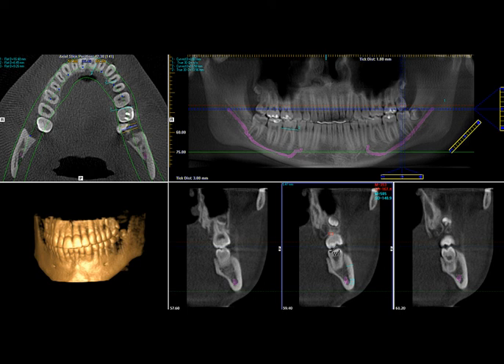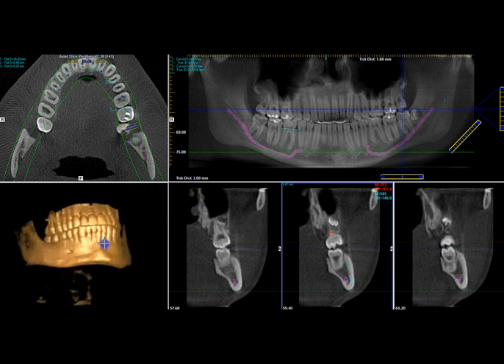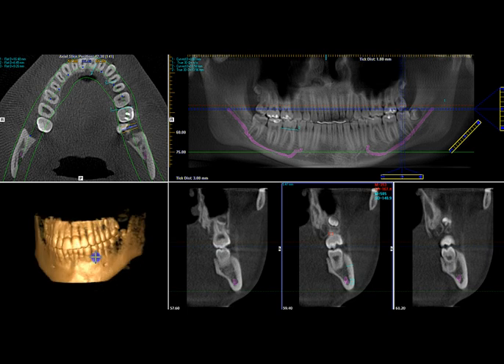The cost of the CT scan becomes an issue. And in the market, it can range. If you're looking for a small view, you can even buy a used one for 50 to 60,000. But a full view of the maxillofacial could run from 100 to 150, in some cases even 200. You can even send it out. The price of getting a CT scan done on the outside can range from about 250 to 400 to 500 bucks, depending on if they want it reconstituted in a 3D format or not.